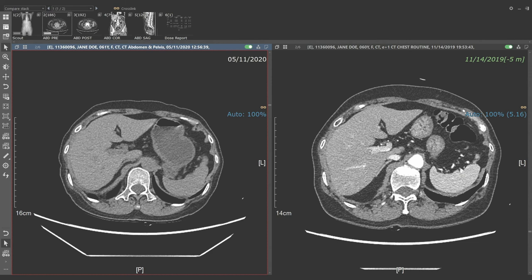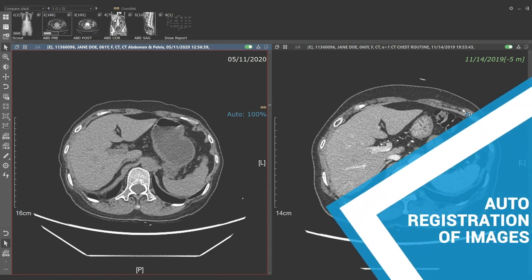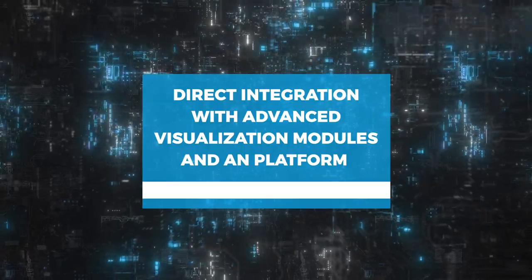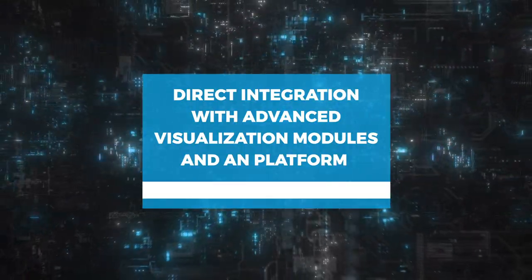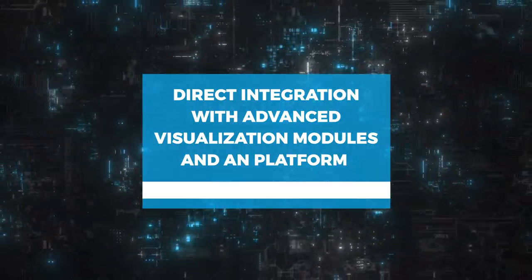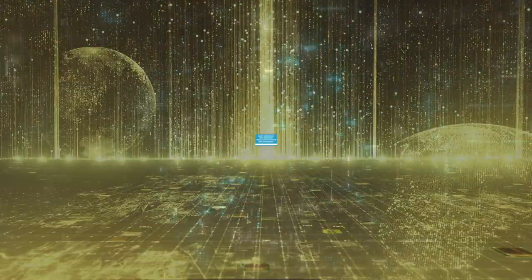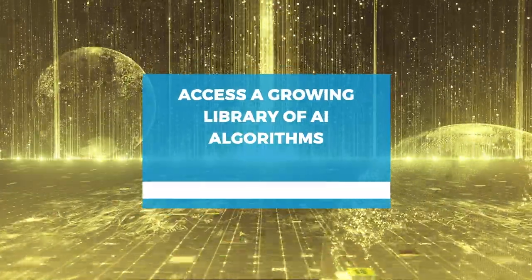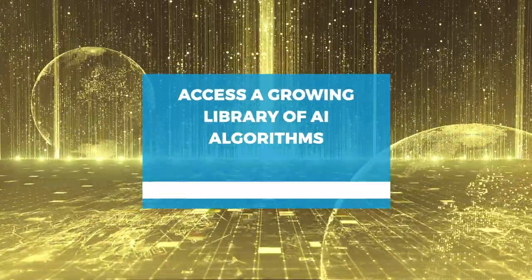When viewing current and prior series for lesion management, an alignment algorithm performs auto-registration of images, matching the current and prior exams to the same slice position. Infinite supports direct integration with advanced visualization modules and an artificial intelligence platform that allows you to access a growing library of AI algorithms.